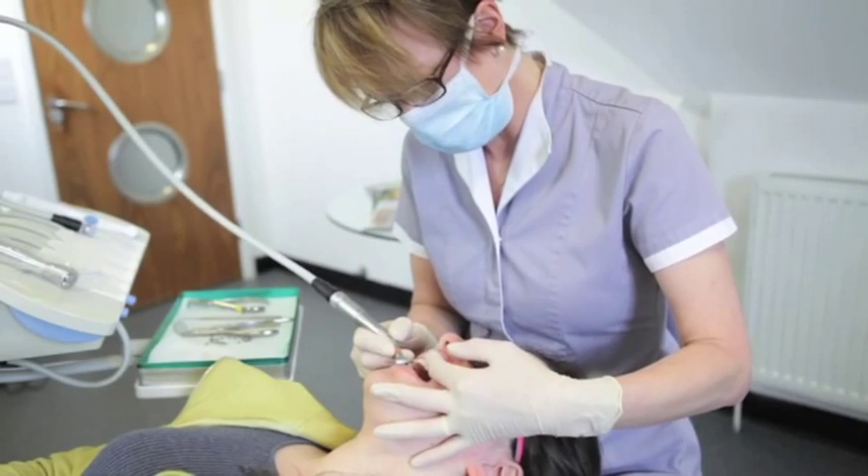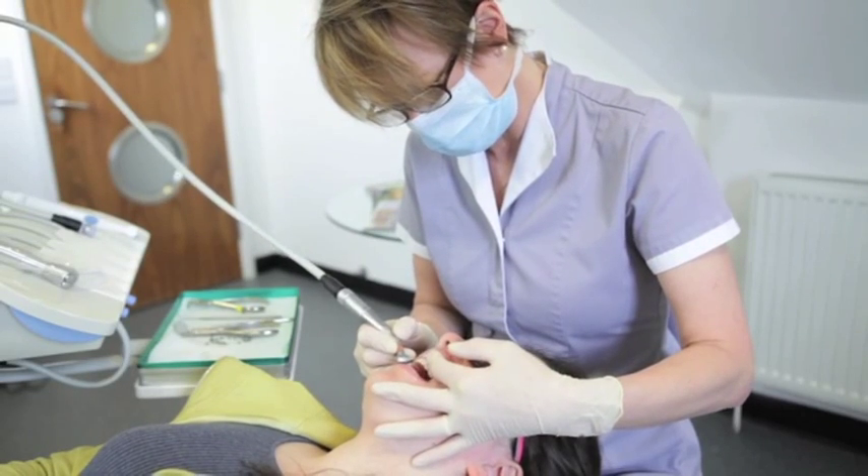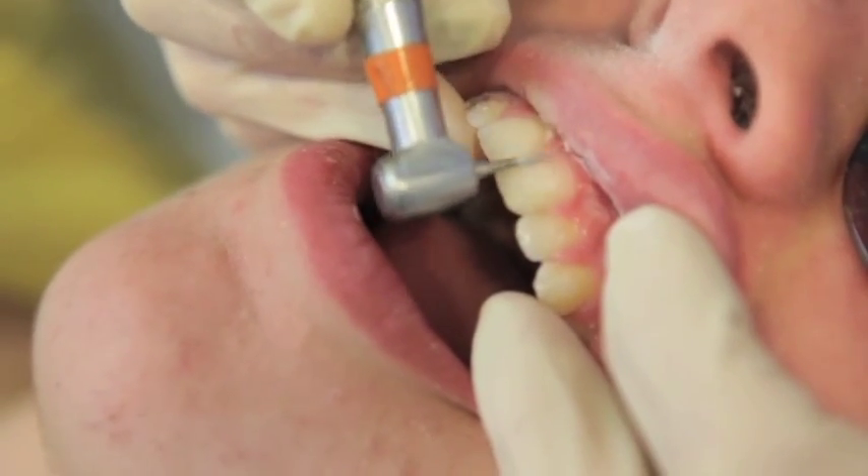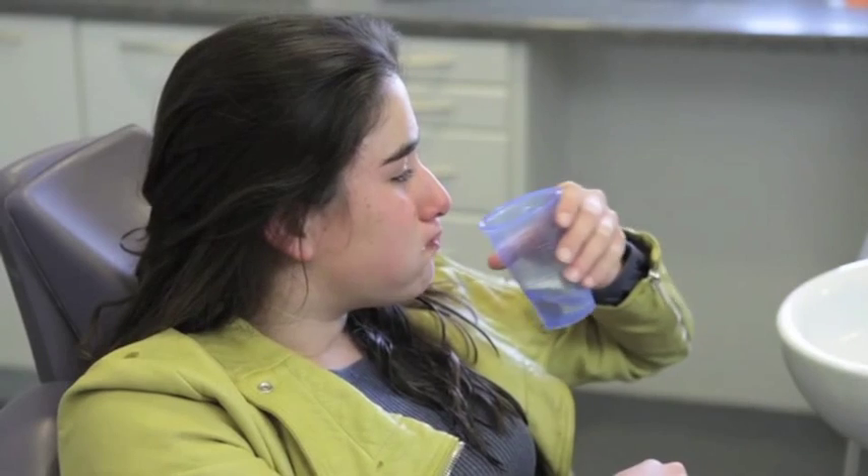Once we've taken the braces off, we need to take the glue off the teeth. And once we've done that, you can sit up and have a good rinse out and give yourself a great big smile without braces for the first time. It's a great moment.